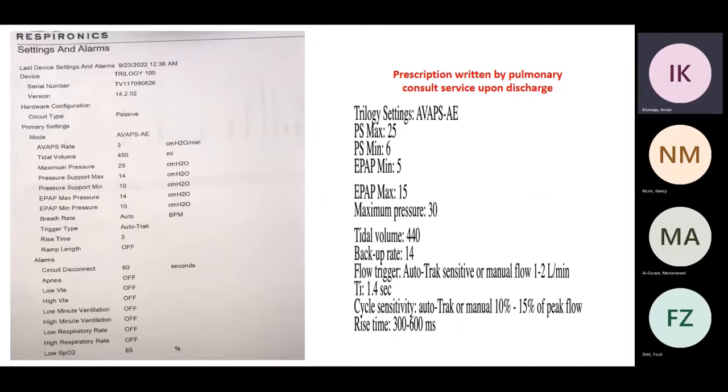By the way, I listened to an entire lecture by one of the world experts on COPD, from Germany, and he said your mask will blow out before you have a pneumothorax. He said, I've been doing this for 20 plus years. So you start with a pressure, let's say in the machine like 35, but the patient doesn't see it. Part of it will escape, part of it will go in the tubing, part of it in the upper airway. So the alveoli don't see this.